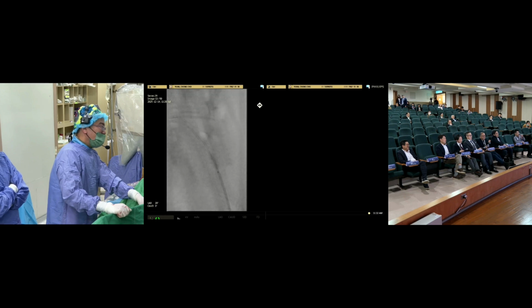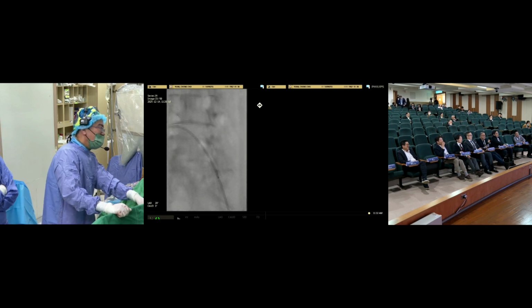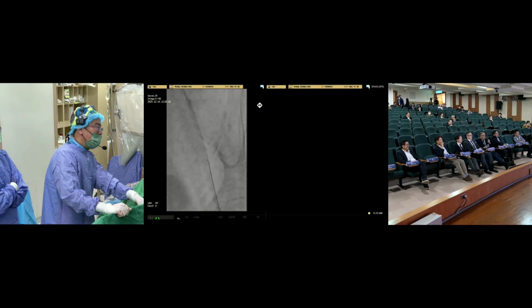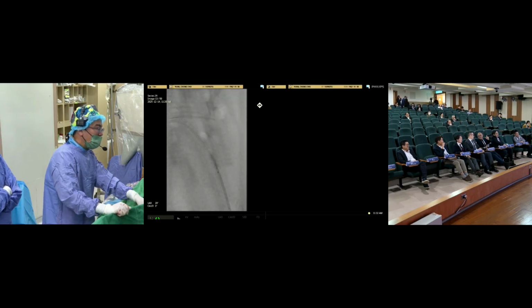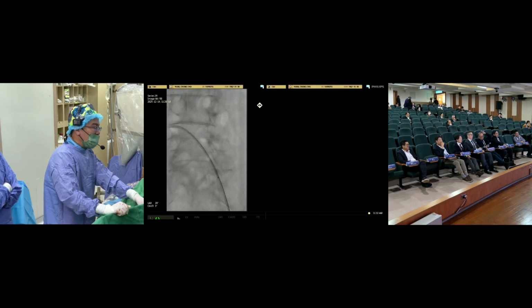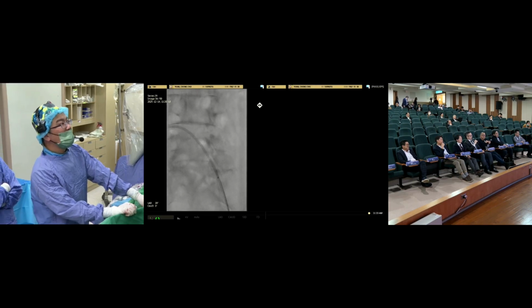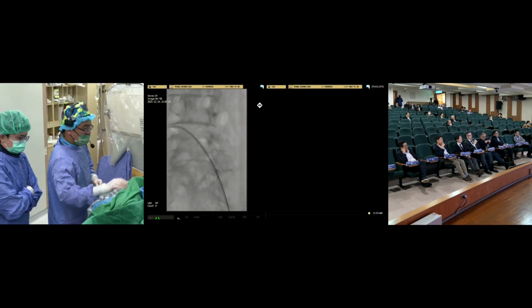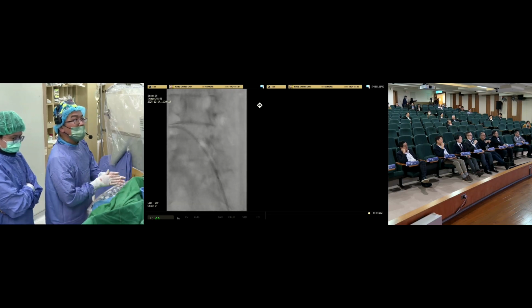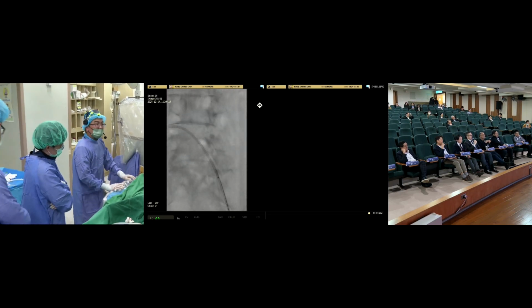So I think it's very fortunate we entered, and we will perform predilation of the proximal part to confirm whether we are in the extraplaque or intraplaque. Please go ahead, and maybe we can move to another room. Congratulations. Thank you.